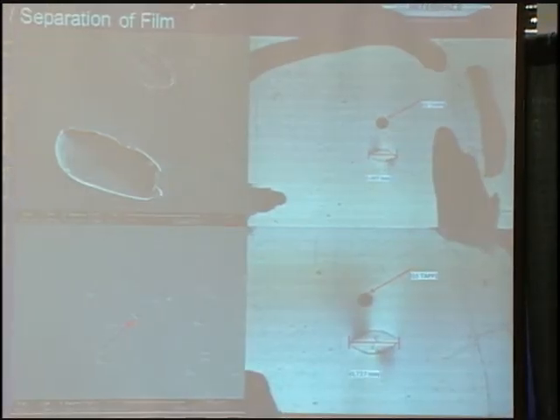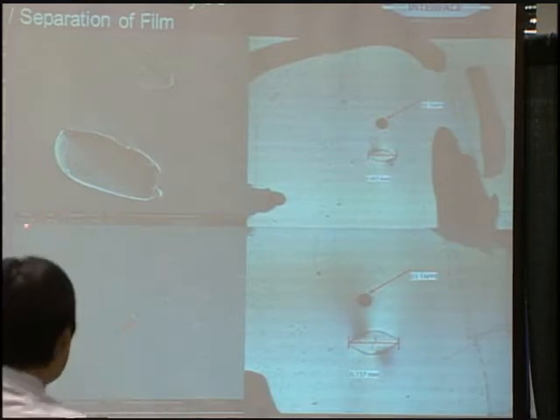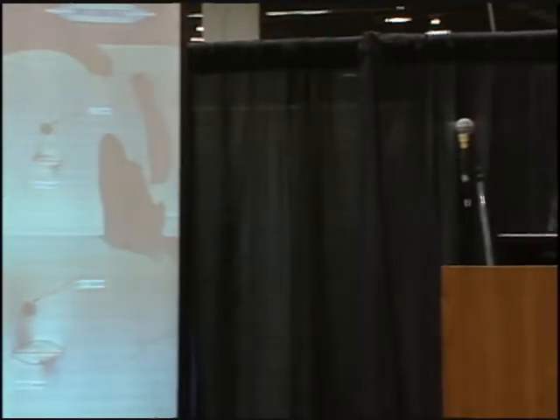And these are just some pictures of what we call fisheyes, which are tears, the separation of film. And this here, we sent this fisheye out. It's 5,000 times magnification on an SEM, and you've got a 20 micron line here. So this is just showing why fisheyes are one of your most detrimental flaws when it comes to balloon burst, performance, fatigue.